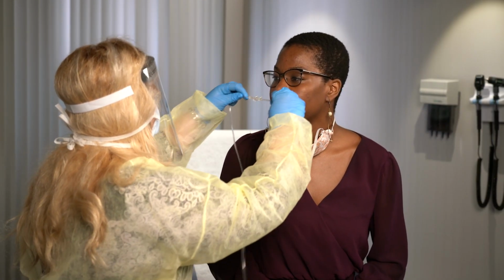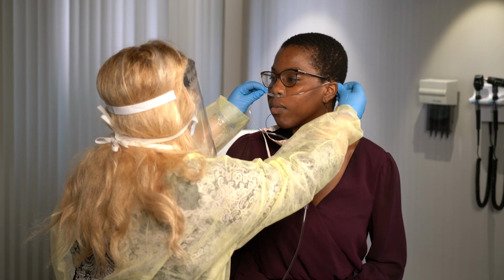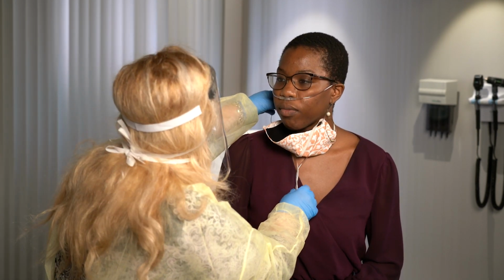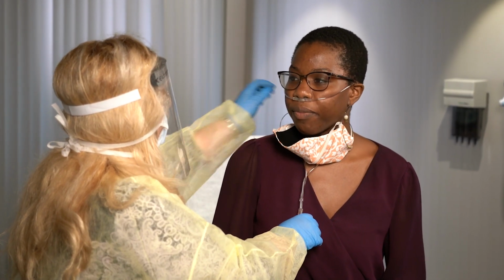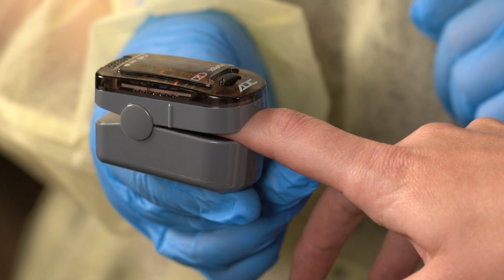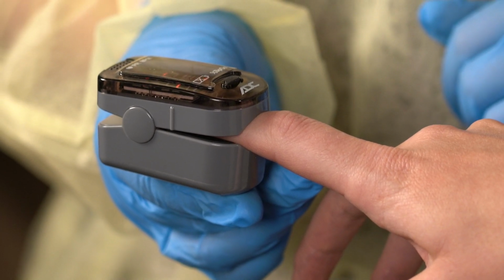To give oxygen therapy, you will gently place tubes into the patient's nostrils to connect them to an oxygen source. These tubes are called nasal cannula. The tubes are very small, so it won't hurt the patient when you place the nasal cannula. While giving oxygen therapy, monitor the patient's oxygen levels with the pulse oximeter.